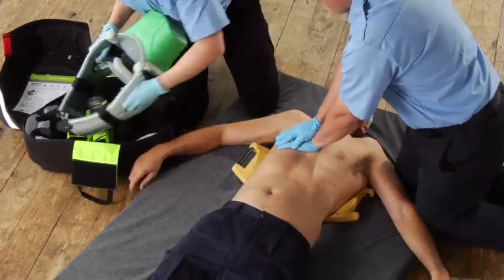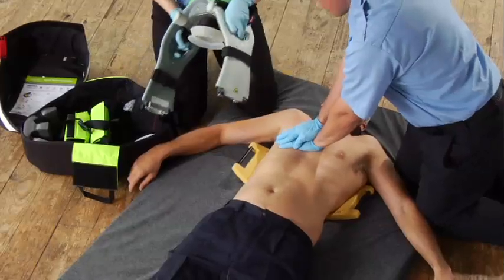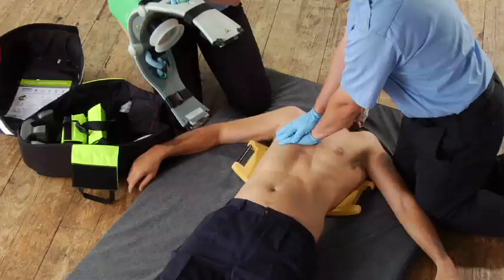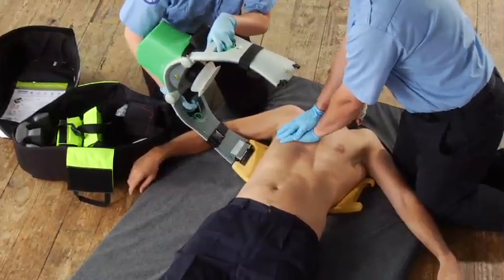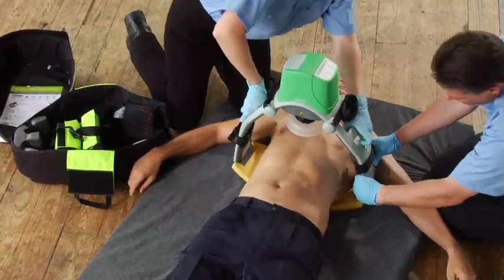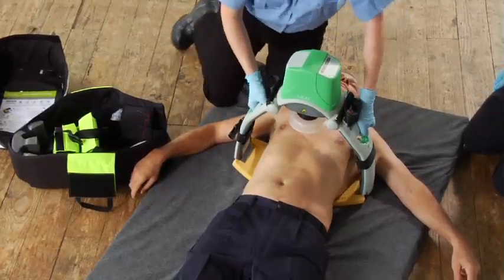Lift the upper part of Lucas out of the bag by the leg handles and it springs open. Pull up on the release rings until the claw locks open. Now click the closest leg onto the back plate — keep fingers clear. Then stop manual compressions and lock in the other leg. Pull up on both legs to make sure they are locked into the plate. That's very important.